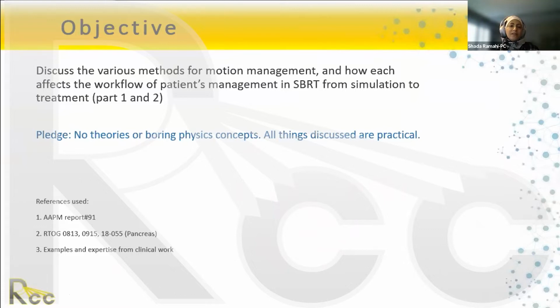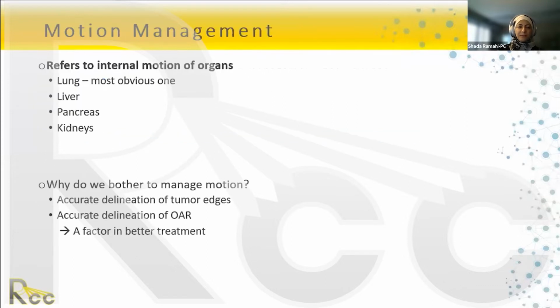Everything we will discuss is applied and applicable, and it's of interest to radiation oncologists, physicists, and therapists. Today's lecture in particular is going to be more of interest to CT sim therapists. Tomorrow will also include the CT sim therapist and the LINAC side therapist. Today we're talking about methods for motion management, how each affects patient workflow, and what you could do to have proper motion management for your patients, even if you have limited capabilities. So this would be towards the end of the lecture.